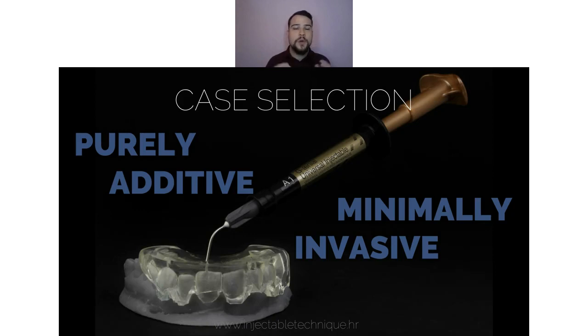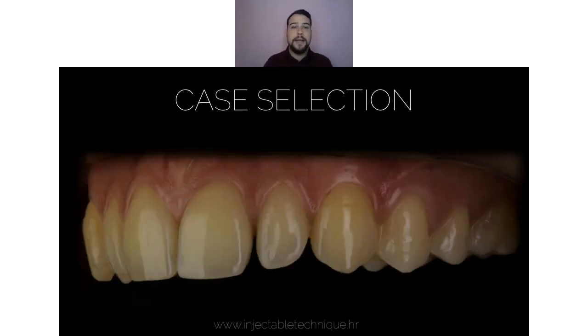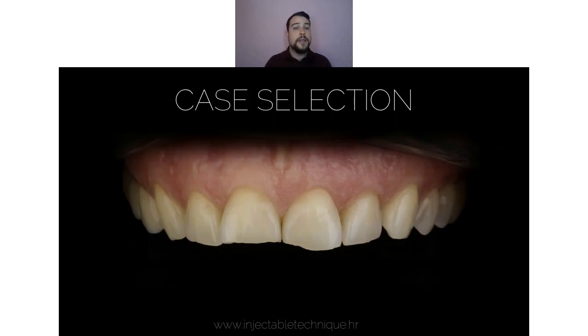So basically, whenever we have a chance to add material to improve the smile of the patient, those cases are indicated for the injectable technique, such as some diastemas or conically shaped teeth, where we need to add material on the mesial, distal, vestibular, and incisal aspects of the tooth. Peg laterals are great cases. This is the case that I already showed you, and you saw how nice a result can be achieved. Of course, some wear cases can be done, but we need to respect the function.